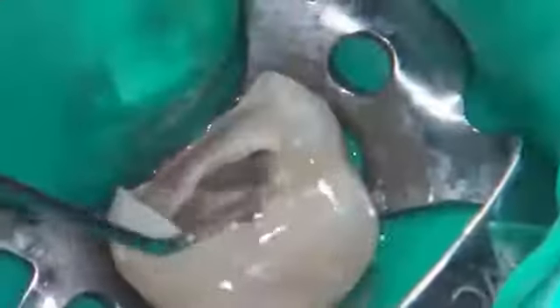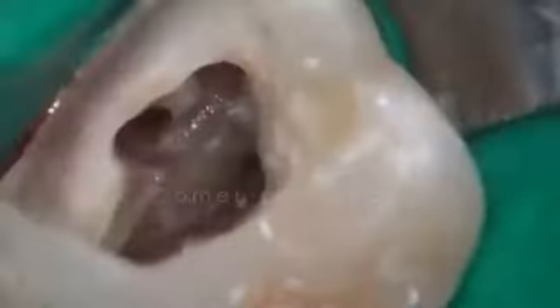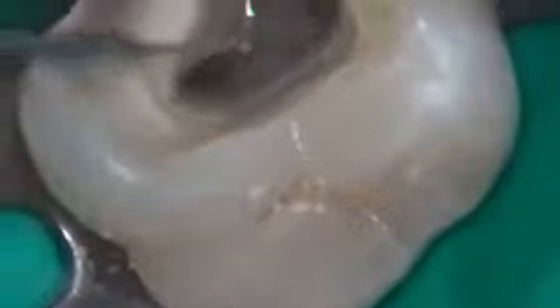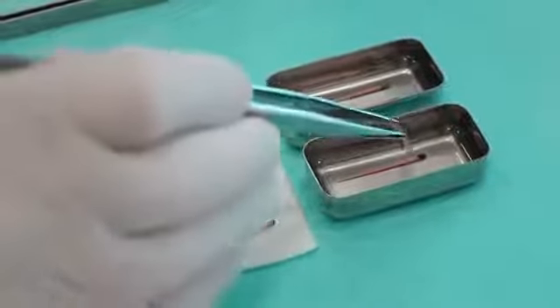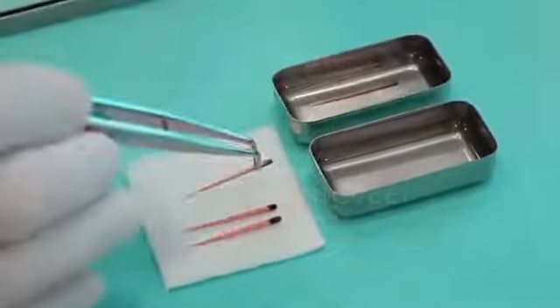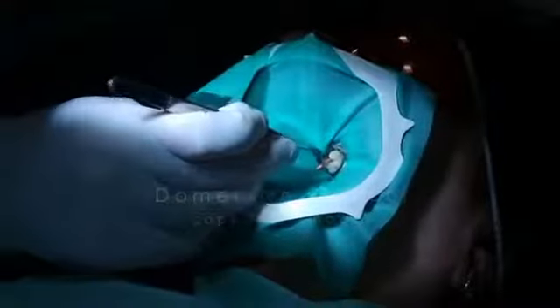Calcium hydroxide was removed with abundant irrigation with sodium hypochlorite. Needles of different sizes were used. Ultrasonic agitation was used to improve removal of calcium hydroxide from the canals. Gutta-percha points were dried on a sterile gauze and tried in the canals.